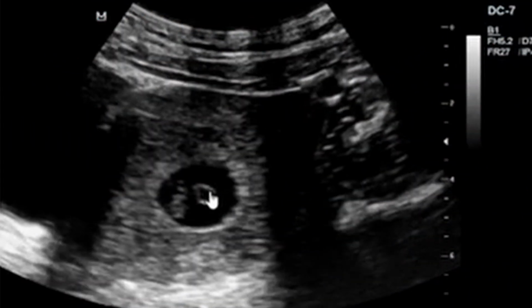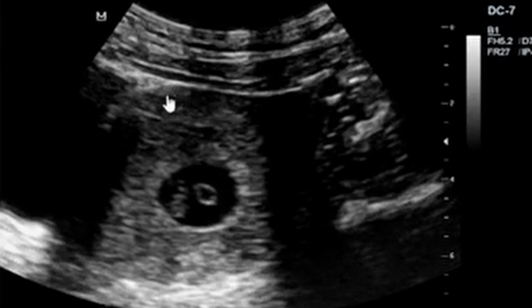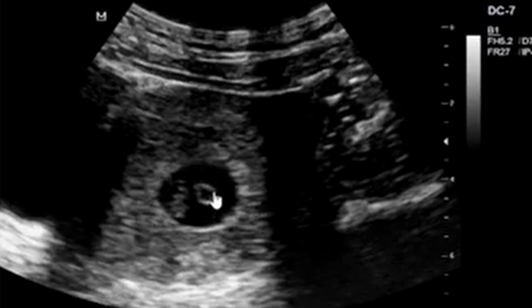I am going to talk about the yolk sac. So what we have here is the yolk sac. You can see this is an early pregnancy, and what we have here is the fetal pole, and you can see this sac that we have here. We have got the gestational sac. That's our uterus, and you can see this is what we call the yolk sac.